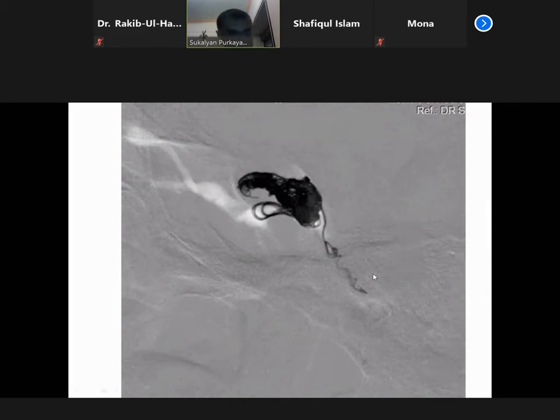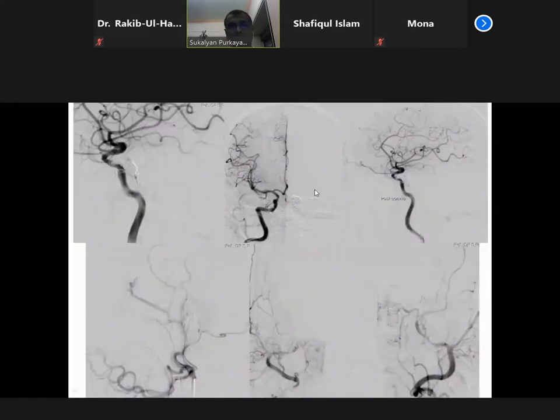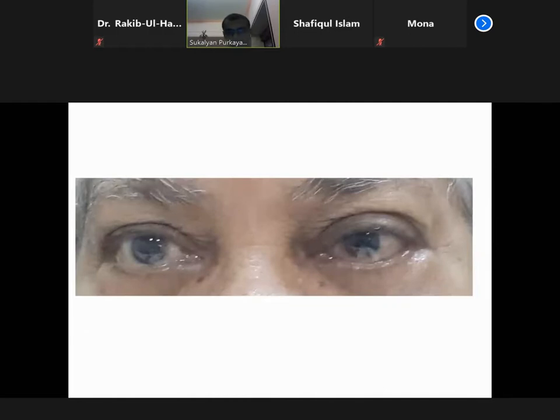What we do in these cases, usually we try with Transcend wires from Stryker. Transcend wires, now it is sold by the Boston Scientific Peripheral Division. Those Transcend stiff wires are quite good for making this route into the inferior petrosal sinus. Usually Traxcess do not do that because it is quite soft. So you can do that and go into the foot of the ophthalmic veins. This is the superior ophthalmic foot, inferior ophthalmic, and the sac of the cavernous sinus you have to block, and the patient will be cured. And this is what we see after the treatment.